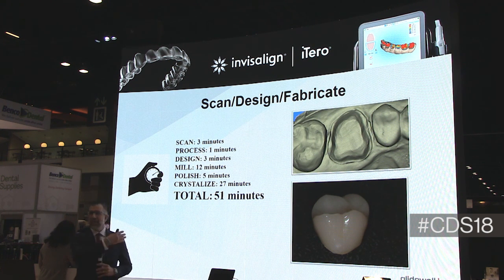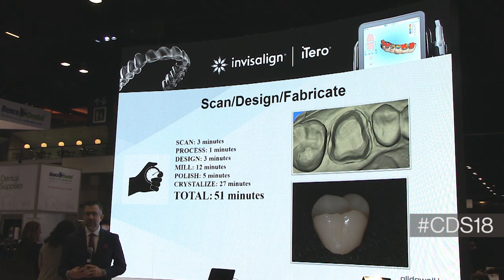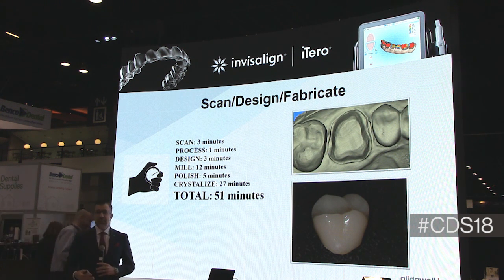So if you'll notice, there's times on the left side of all these slides. What I would say is for your first few cases, add about 30 minutes to the times that I present, because all of these cases were timed so that we could see how they work in our office for scheduling purposes. So we scan, it takes about 3 minutes.